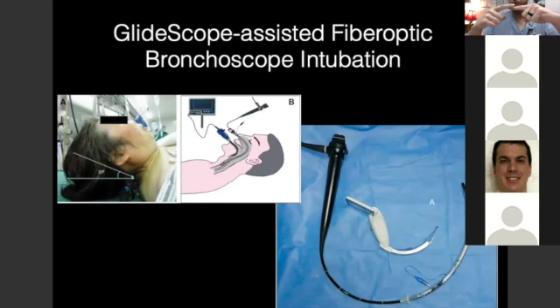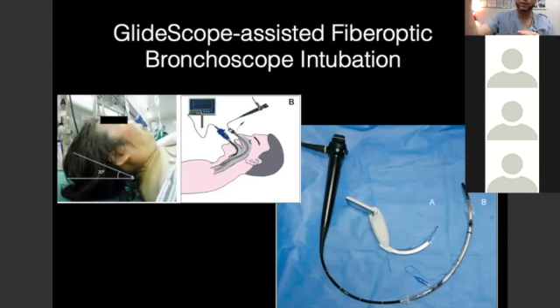Maybe I'll take a tongue depressor, wrap some gauze around it, soak it in 4% lidocaine, and put it in so they kind of gag on it, which shows that it's on the right spot that causes a gag, the 9th nerve, and let that kick in a little bit. Or maybe I'll pull the tongue out and drip a little 4% lidocaine out of an angiocath on the posterior third of the tongue. But once the gag is gone and they're well sedated, you enter the mouth with the fiberscope, you see the chords, and that's when you spray your last couple cc's of 4% lidocaine through the working channel.